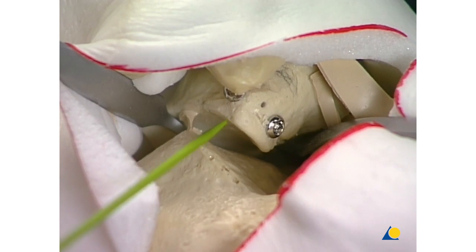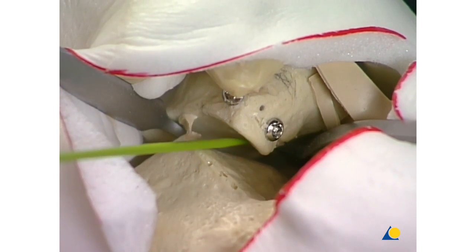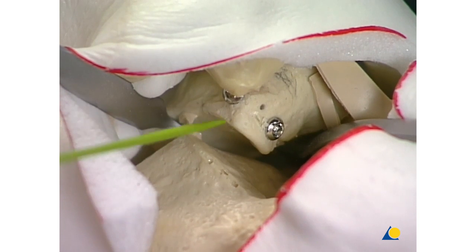The control of the posterior facet must be very precise and is eased by distracting the joint using the femoral distractor.